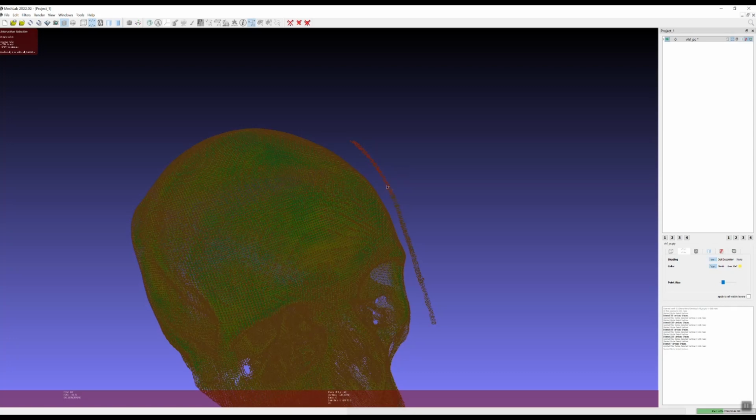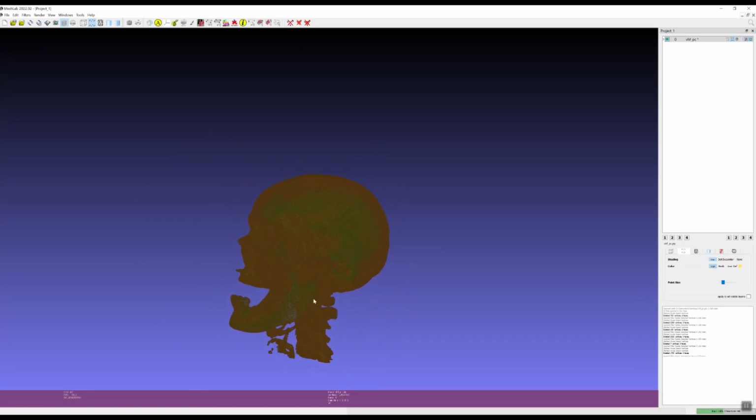If you do accidentally select too much, you'll notice up here, you've got a little help box. You can hold the shift key to subtract, or you can also just click out of it and reselect. If you start a new box, then it's going to basically deselect what you had selected before. So it gets to be kind of quick. It can be very quick once you get the hang of it. Delete. Okay, so I'm not going to bother with all of these other things.